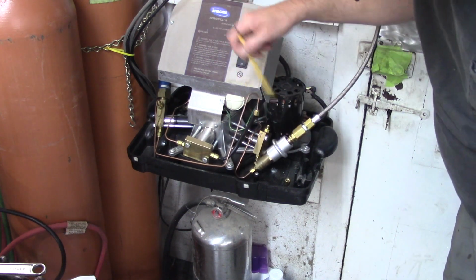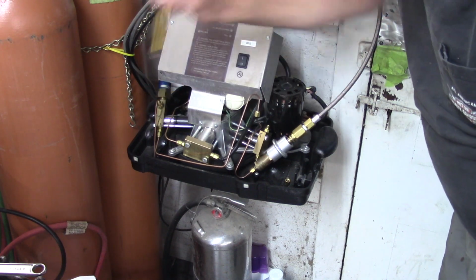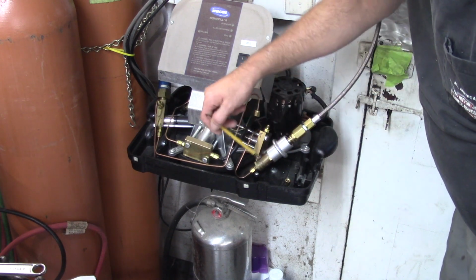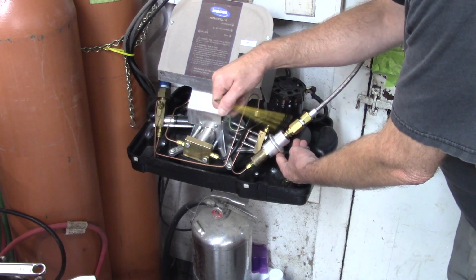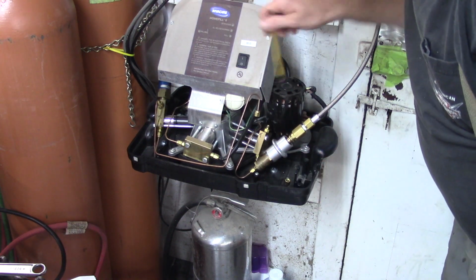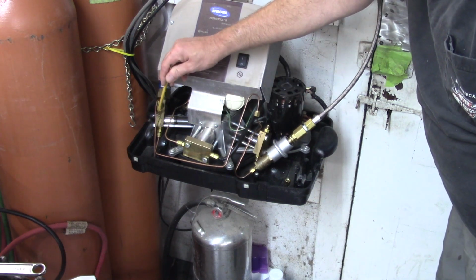I also disconnected cylinder number 3 into cylinder number 4. So cylinder number 3 is over here that you can't see. This is the cylinder number 4 in, and you'll notice that this is the filling valve, check valve. This is my whip hose. So I'm going directly from cylinder number 3 right out of the system. I bypassed cylinder number 4 and cylinder number 5.